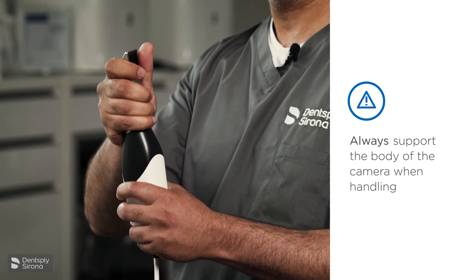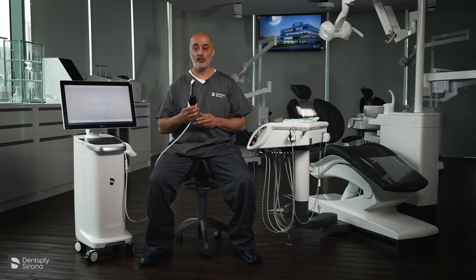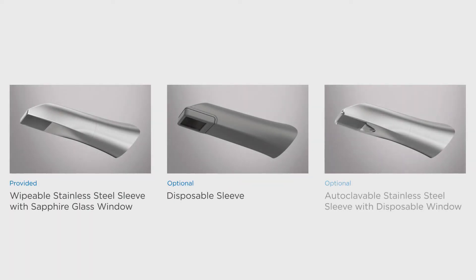The Prime Scan camera is provided with a standard head. You also have the option for two other heads — one is disposable and one is autoclaveable.